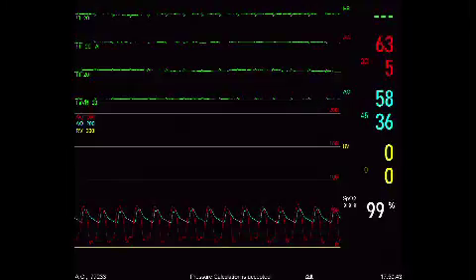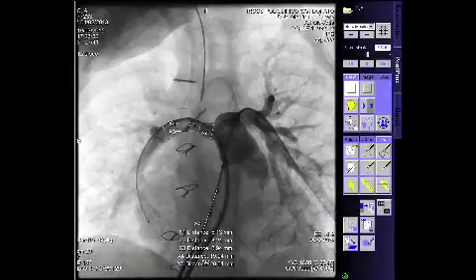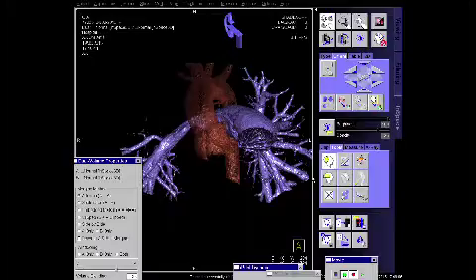I would also like to show you some angiographies and 3D rotational angiographies we have done. Gregor, please go ahead with the 3D. For angiography, we did a simultaneous injection in the left ventricle, 49 milliliters at 60% contrast, so something like 30 milliliters of pure contrast. At the same time, right ventricular injection through a 6 French sheath with rapid pacing, the same amount, so we have something like 100 cc, which is actually around 60 pure.